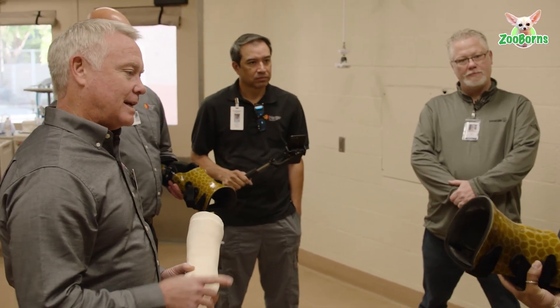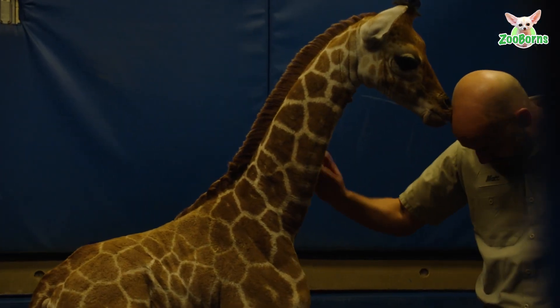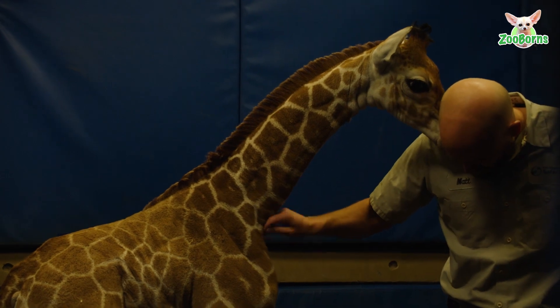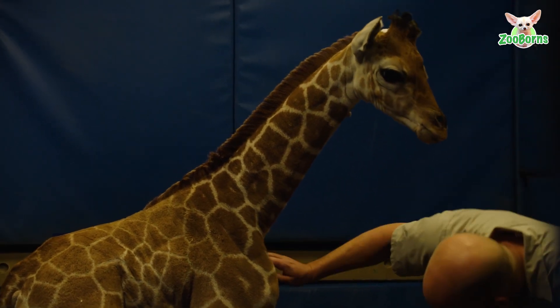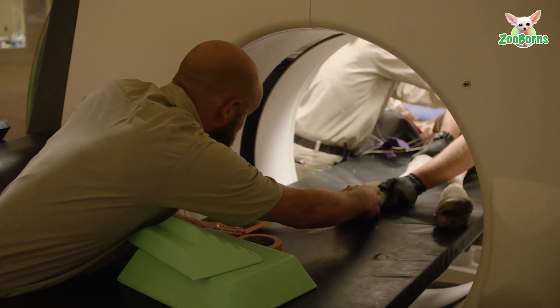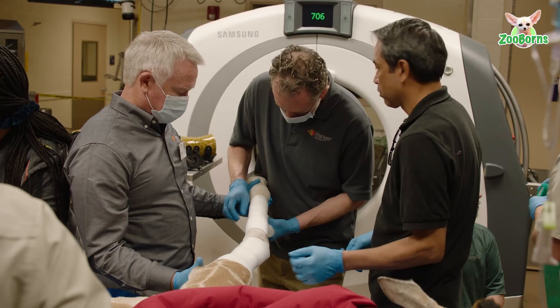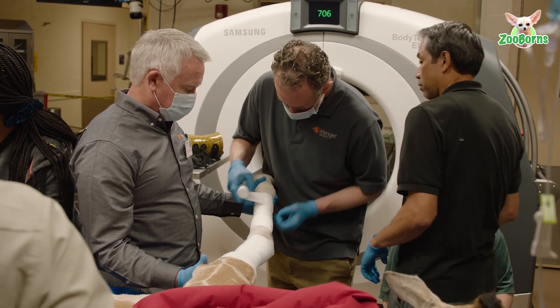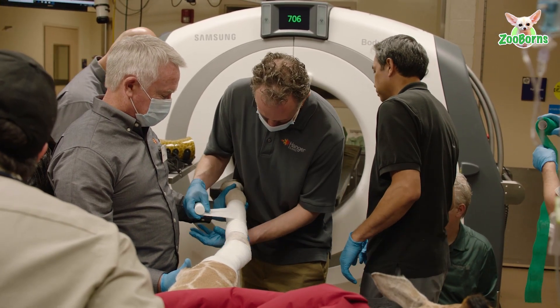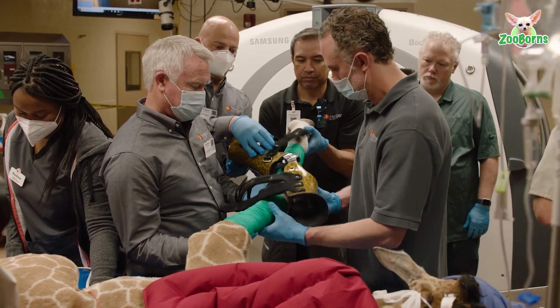The second brace was actually a custom molded brace. When we first saw the giraffe, we took cast molds of both legs and fabricated those — it took about a week. I've never done this for other wildlife. This is the first time in my 30-year career that I've done it for any type of wildlife. It's a sense of accomplishment — I think it's the best thing I've ever done. It's a once-in-a-lifetime opportunity and you just have to savor the moment.